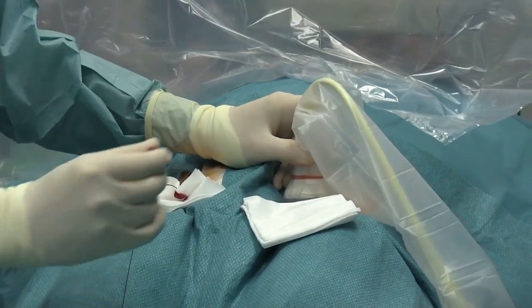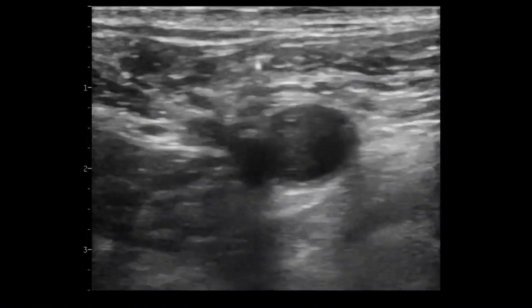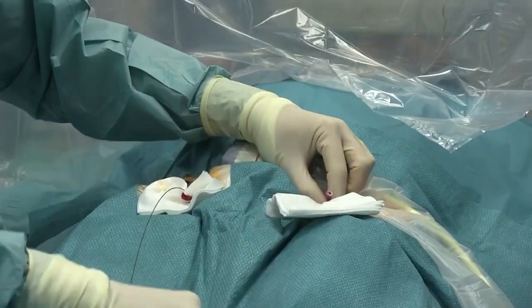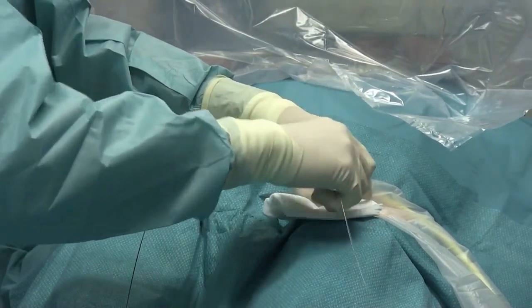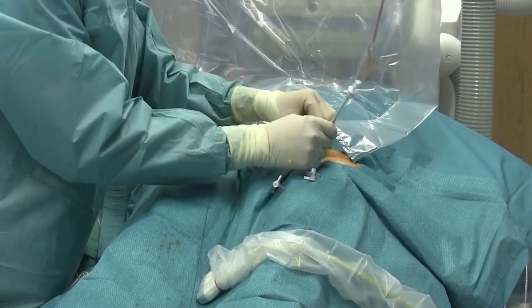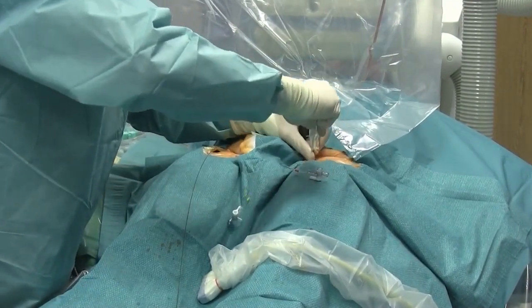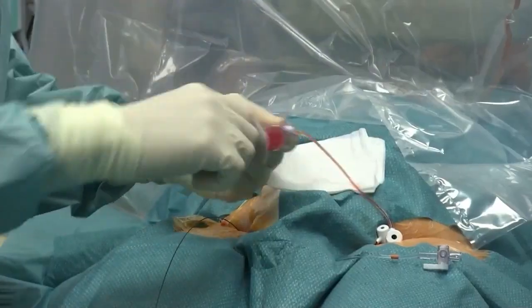Femoral veins in the left groin are cannulated in similar fashion. These are used for intracardiac echo and CS catheter. During puncture, small tethering movements with the needle may help to visualize the needle location and direction. 7 French and 11 French sheaths are inserted over the wires. Once in place, all are flushed with saline.